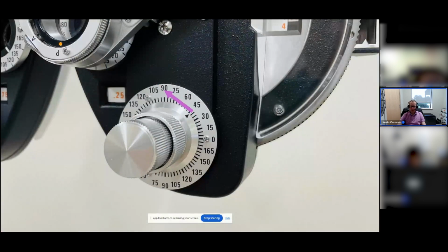So again, the best way to do this is to practice. It is confusing, I understand, and this is again the hardest part of refracting, knowing how to use the Jackson cross.